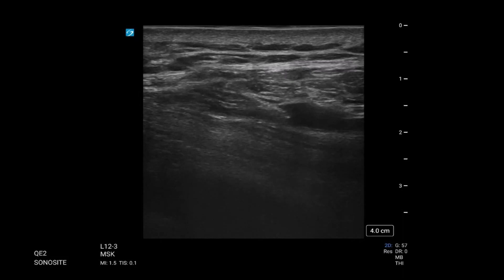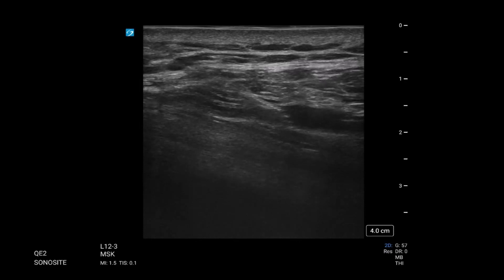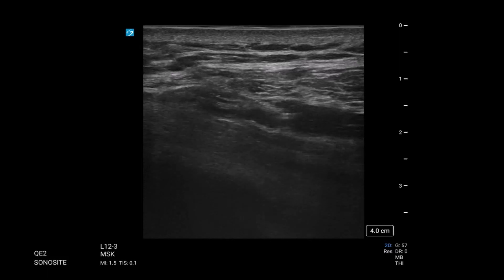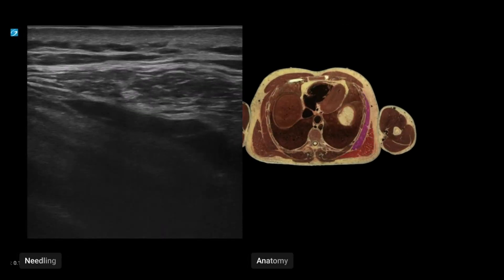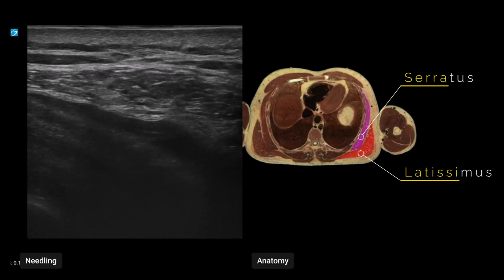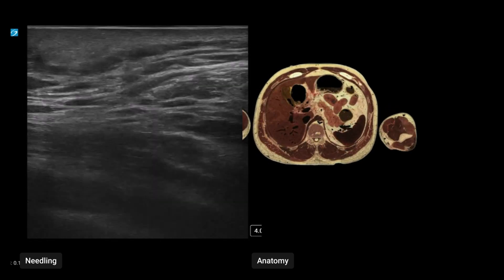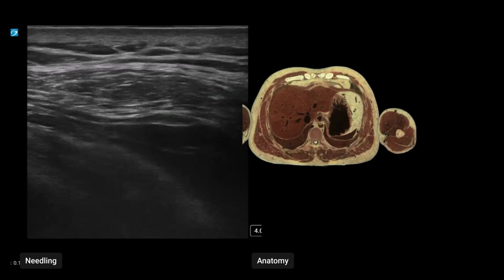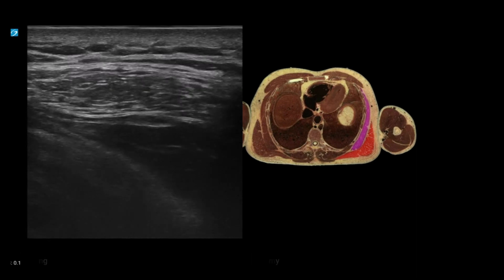The slightest movement and we're now too superficial, so we have to pop back in under this fascia. We'll readjust. Now, if we wanted to, we could move forward, but keep in mind we do have a vessel here. For a single shot, quite often we'll just leave it — it's good enough. The more you poke and prod, the more likely you are to hit something you don't want to hit. If we were doing a catheter, we would chase the posterior border so there's more of our needle or catheter within that fascial space. A post-block scan confirms how much local has been pushed posteriorly along the border between latissimus dorsi and serratus.